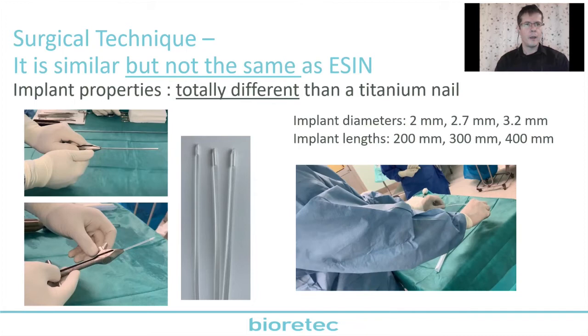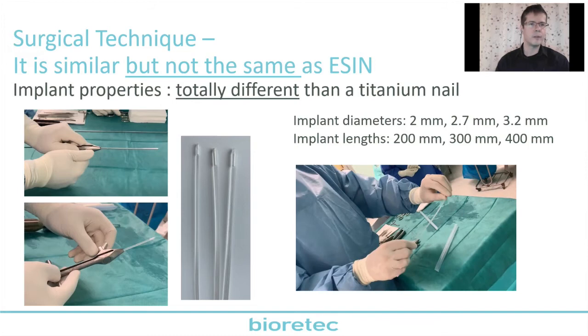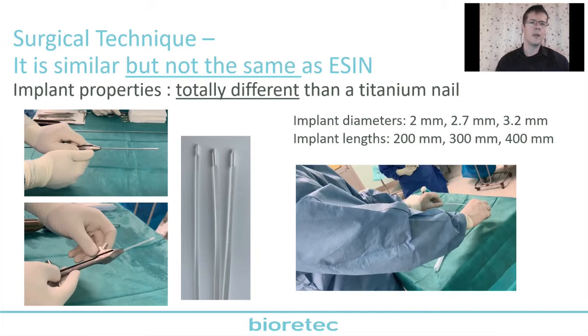The surgical technique is very similar, but it is very important that it is not the same as the ESIN technique, because the implant properties are totally different. We can see here it is a very elastic implant, and we don't have the chance to reduce with this implant. We use other so-called dilatators to make the reduction.